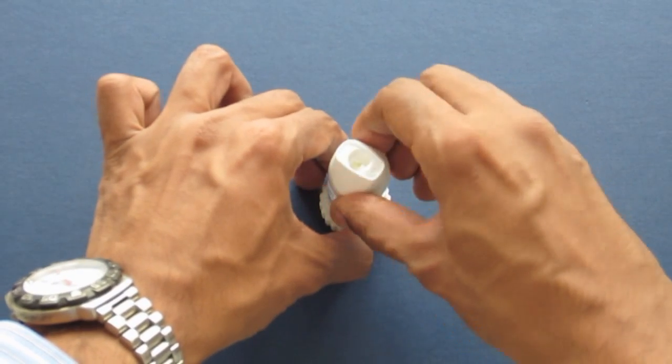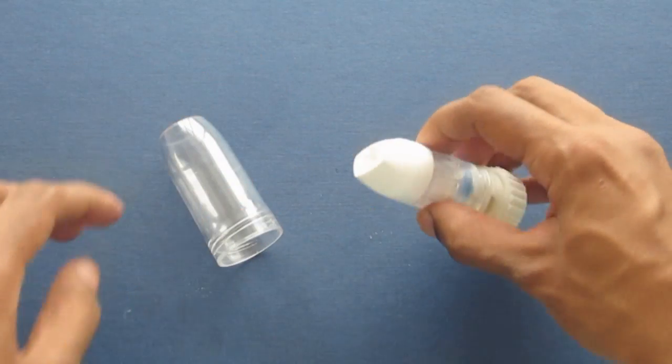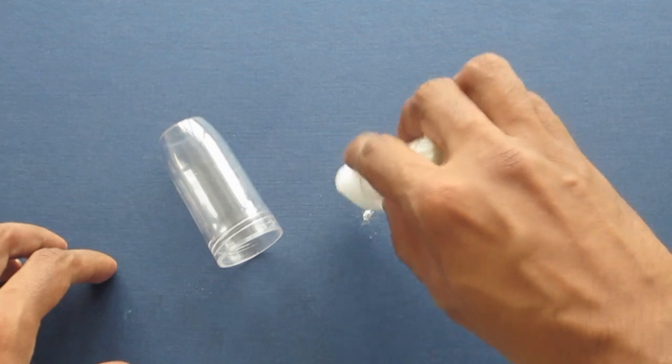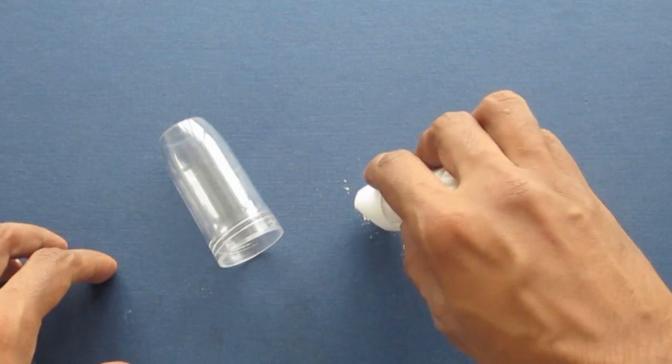Turbohaler adalah sama seperti Accuhaler. Ia mengandungi ubat di dalam bentuk serbuk. Anda perlu tarik nafas yang dalam untuk mengeluarkan ubat tersebut.